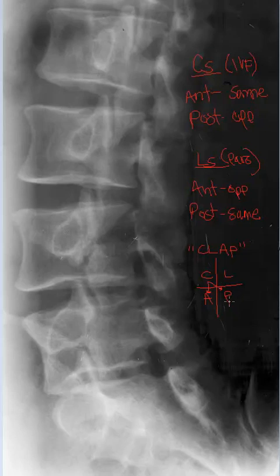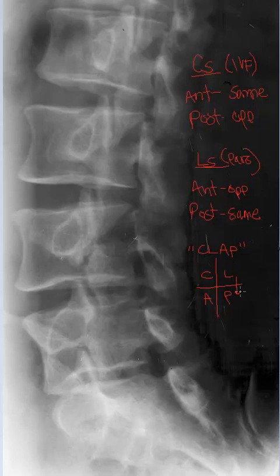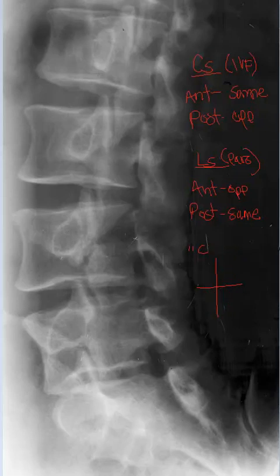For the lumbar spine, the opposite is true. If we took posterior obliques we'd see the same side — notice that these letters are on the same side. If we took anterior obliques we'd see the opposite side pars inter articularis. If the CLAP mnemonic works for you, use it; if not, don't — but it has proved to be somewhat useful.